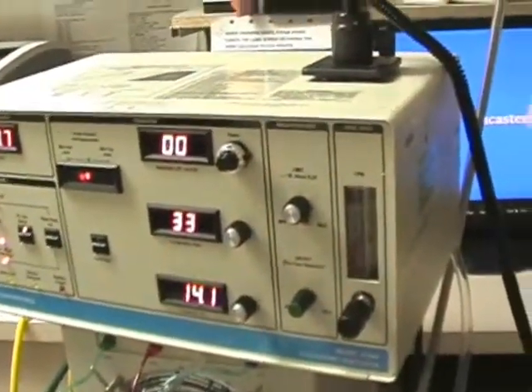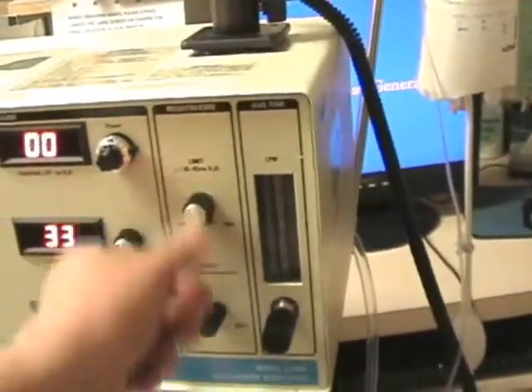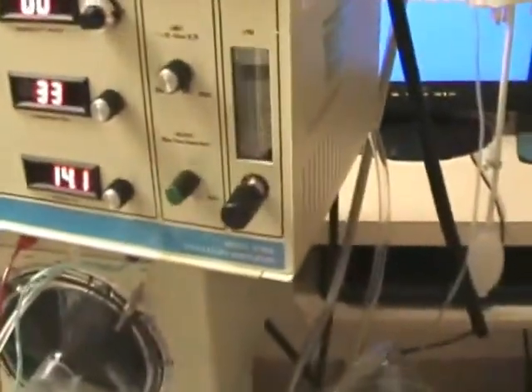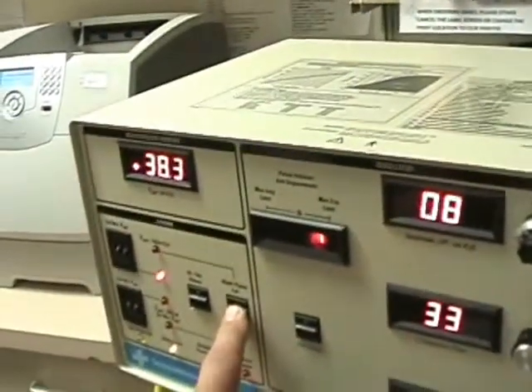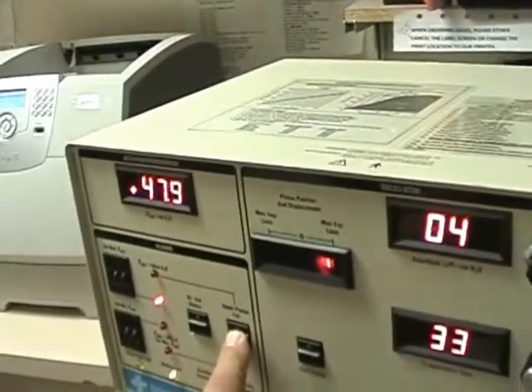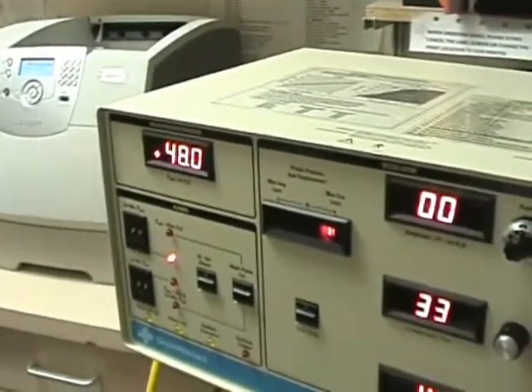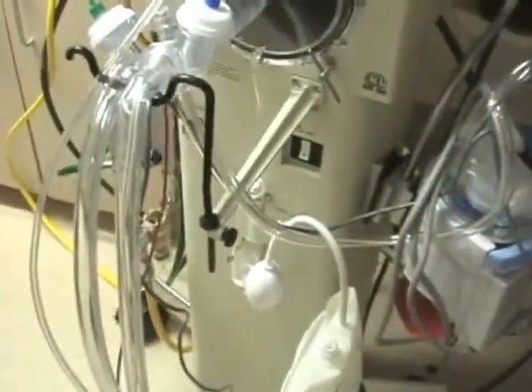Okay, so the patient circuit calibration, these are turned to max. Flow is at 25, 20. Okay, and then we pressurize until we get to, we have to be at greater than 39. Greater than 39, and that's at 48. So then that indicates that we have no leaks in the system.